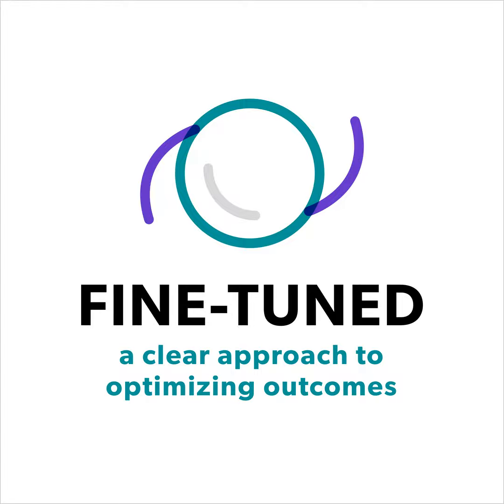What are the drawbacks of not treating higher order aberrations during LASIK? And what are the advantages of treating higher order aberrations? At the very least, we don't want to induce higher order aberrations when performing LASIK, and I see no reason not to try to target higher order aberrations and reduce them if possible. Some higher order aberrations can contribute toward visual phenomena such as halos, which is especially true in highly aberrated eyes with residual refractive error. By addressing these aberrations with wavefront guided retreatments, we can reduce or even eliminate these side effects for many patients.